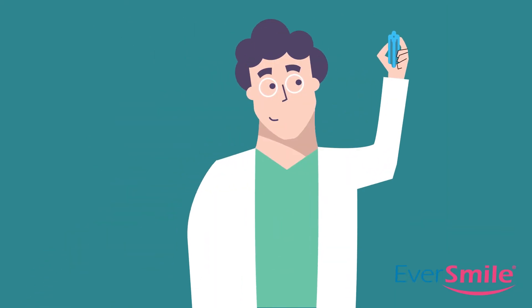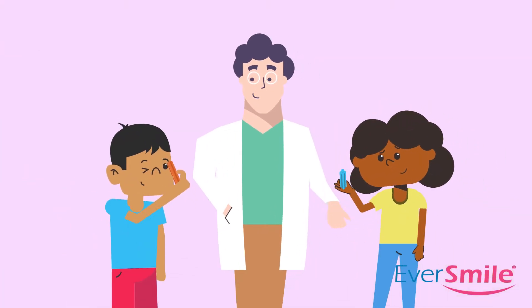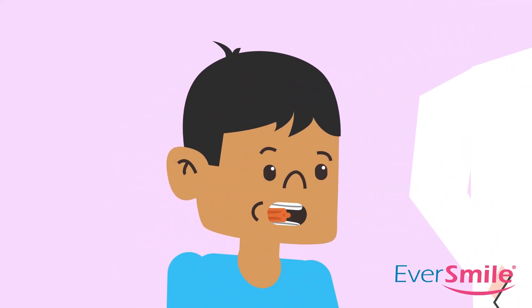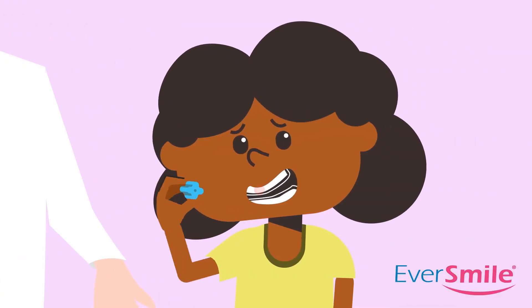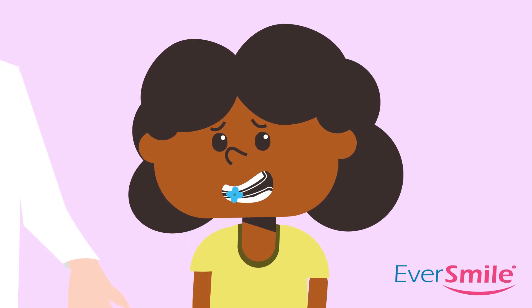OrthoChews are easy to use and help target problem areas or an entire quadrant of your mouth. To target a problem area, place the edges of your teeth along the grooves of an OrthoChew, then repeatedly bite down, gently relieving pressure. To relieve irritation on a specific tooth, place the soft edge of an OrthoChew where you feel pain and repeatedly bite down gently.